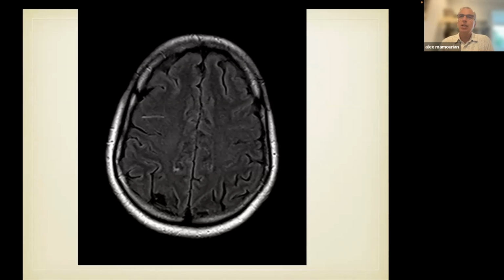I think there was a recent study comparing CT imaging with lumbar puncture and other studies. So what's the number? I think it depends on the reader, but it's small. It's probably in the 5% range, maybe under 5%, but it's not zero. And the challenge for the individual seeing the patient in the emergency room then is, do we do a spinal tap in every middle-aged patient with the worst headache of life and a negative CT scan?